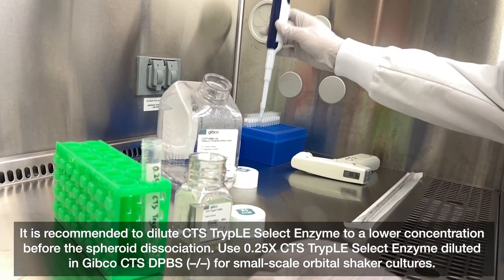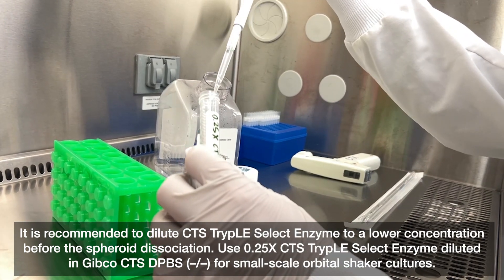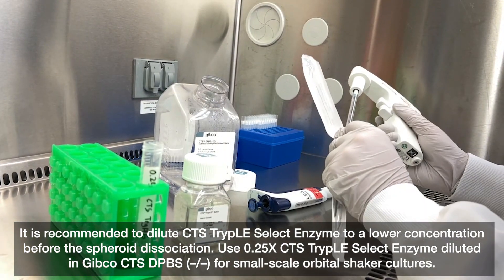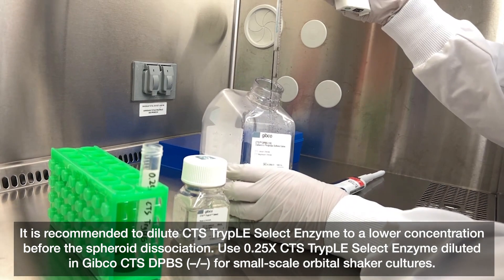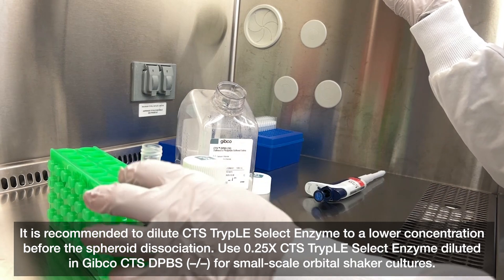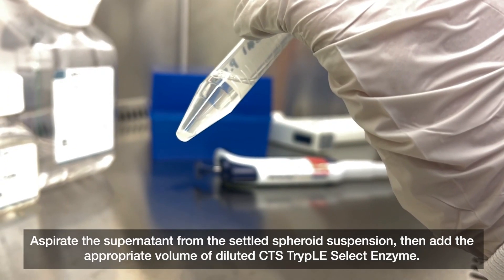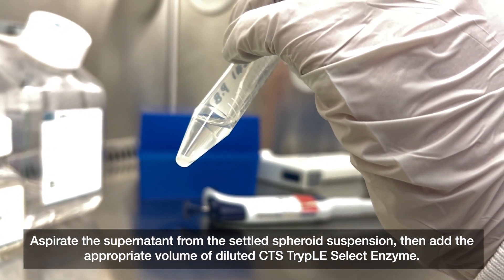It is recommended to dilute CTS TrypLE Select enzyme to a lower concentration before spheroid dissociation. Use 0.25x CTS TrypLE Select enzyme diluted in Gibco CTS DPBS (no calcium, no magnesium) for small-scale orbital shaker cultures. Aspirate the supernatant from the settled spheroid suspension, then add the appropriate volume of diluted CTS TrypLE Select enzyme.